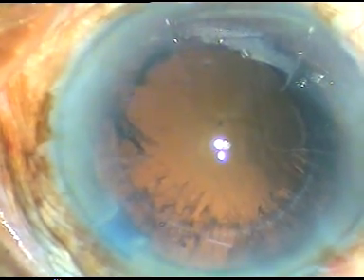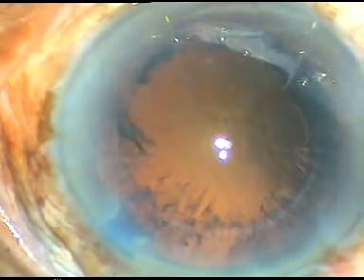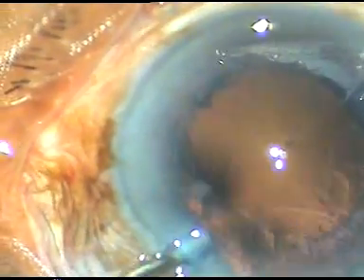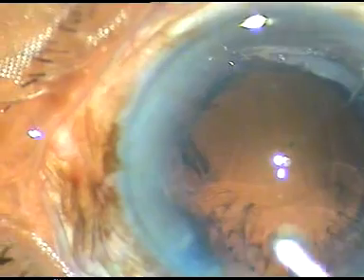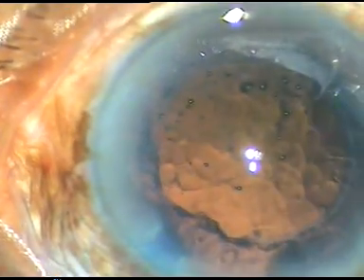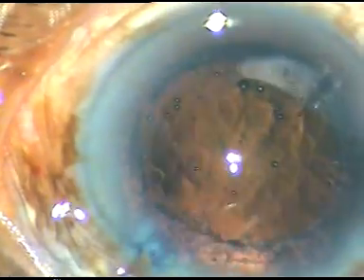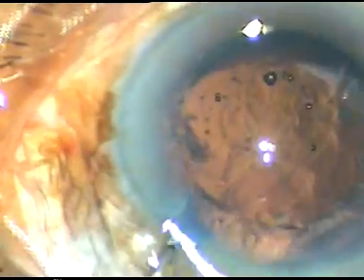Now cortical cleanup is to be done. One can use bimanual IA at this stage or coaxial IA, whatever you are habituated with. Just use that instrument, but whatever you do, just clean the cortical matter very nicely.